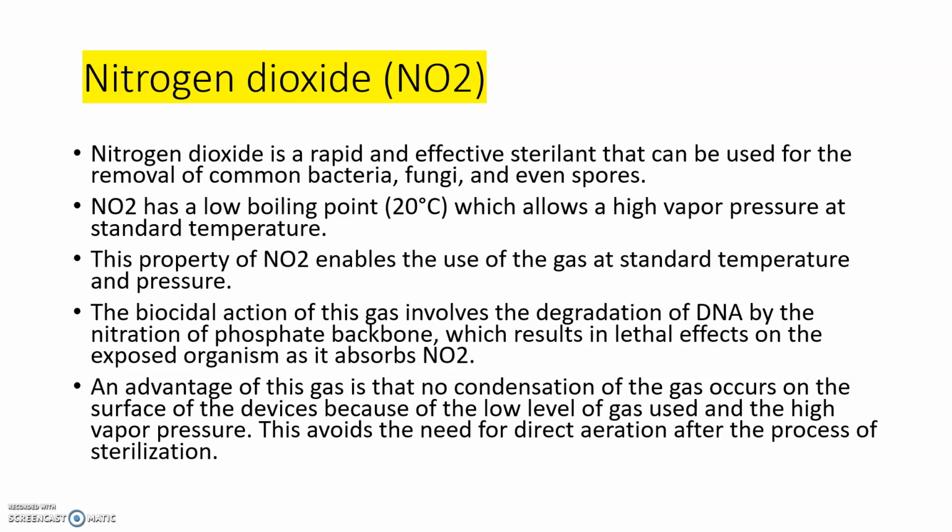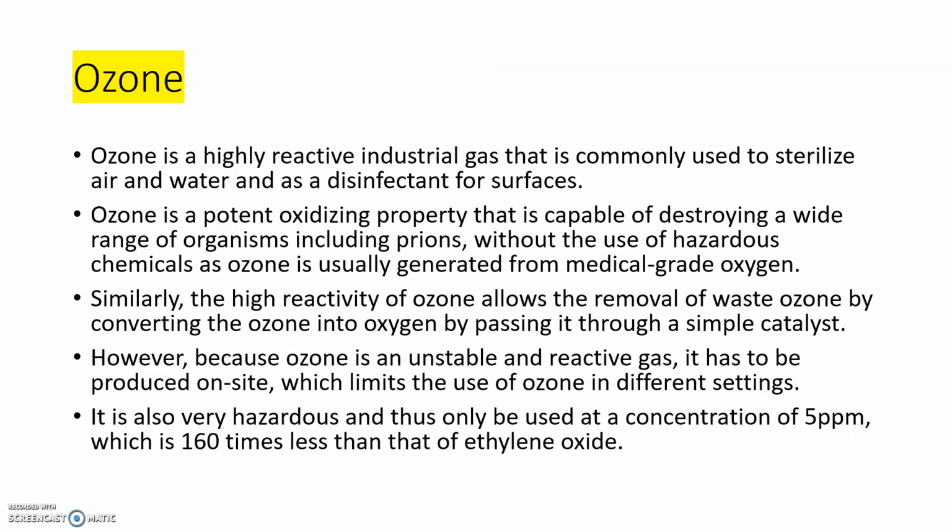and it may result in lethal effects on the exposed organism because they absorb nitrogen dioxide. An advantage of this method is that no condensation of gas occurs on the surface of the device. Why? Because of the low level of gas used and high vapor pressure. This avoids the need for direct aeration after the process of sterilization. So there is no need for direct aeration.